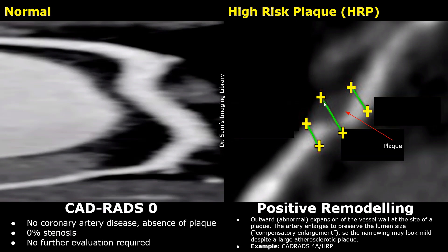The stenosis seems to be between 70% and 99%, so this will be classified as CADRADS-4A HRP. The plaque burden score is not needed if HRP is used.